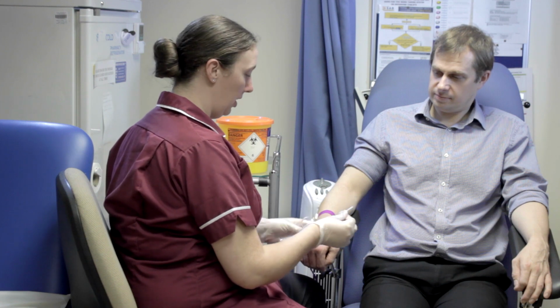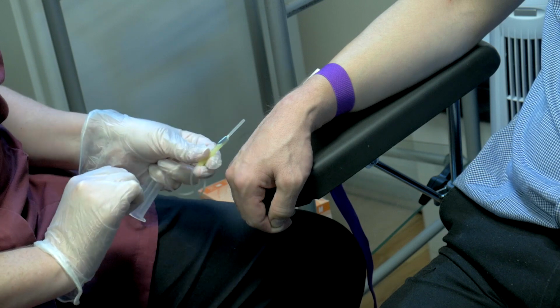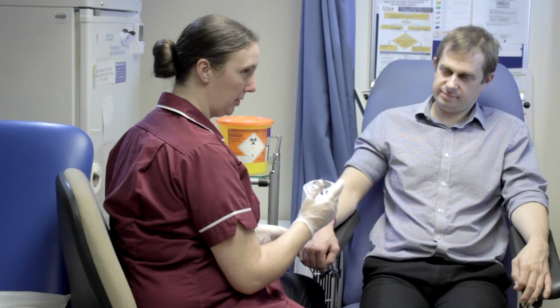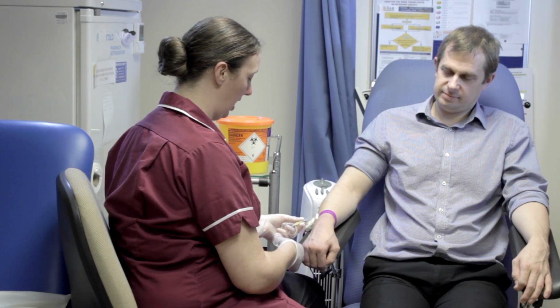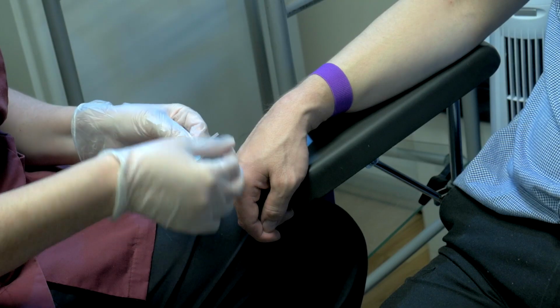And then I'm going to pick up my winged infusion set, and the bobbly bit is the bit that goes against the patient's skin, and the bit with the 23 gauge writing and BD goes facing up towards the ceiling. That's because that's where our bevel is, and we always want our bevel to be facing upwards. I like to hold it by one of the wings, just so that I can see when I get the flashback of blood in the yellow part.